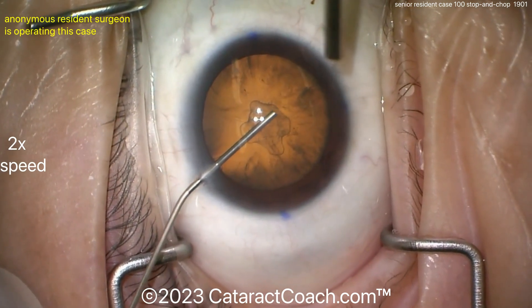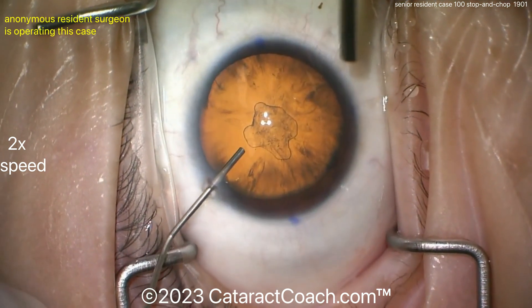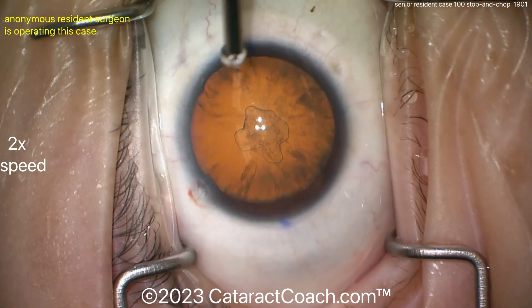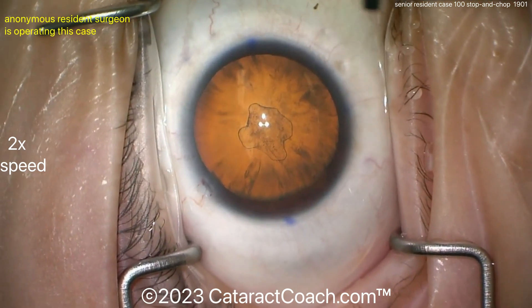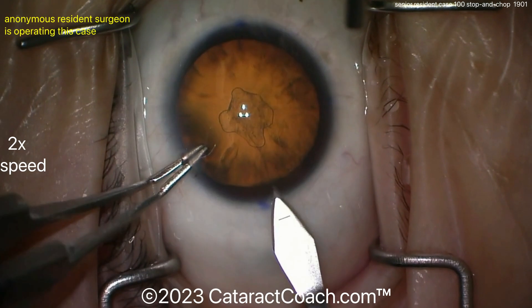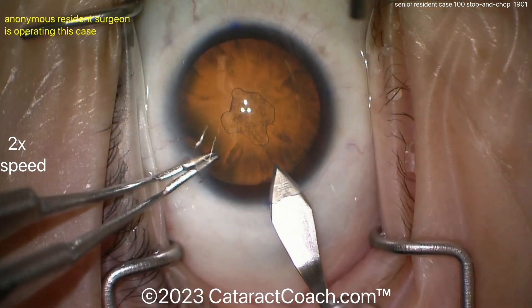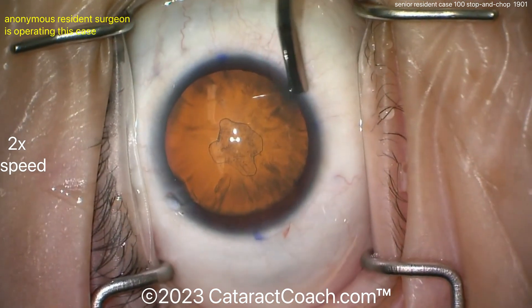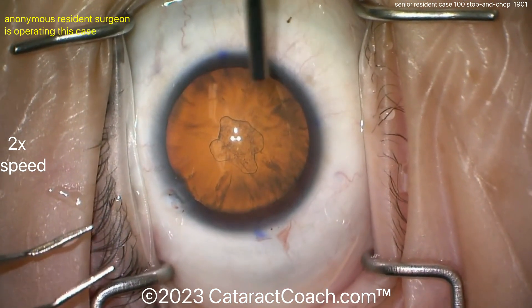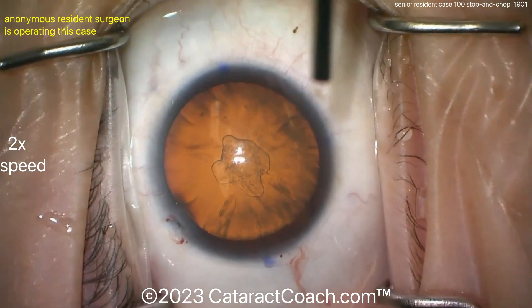You can see viscoelastic going inside the eye — very nice feel there. Looks like some markings at the against-the-rule axis at 180. That's a nice firm eye with good dilation. Now let's see the incision technique: holding the eye through the paracentesis. Here's the keratome — looks like a single plane, a little short on the incision, but not so bad. I like the nicking of the limbal vessels; that's very helpful.